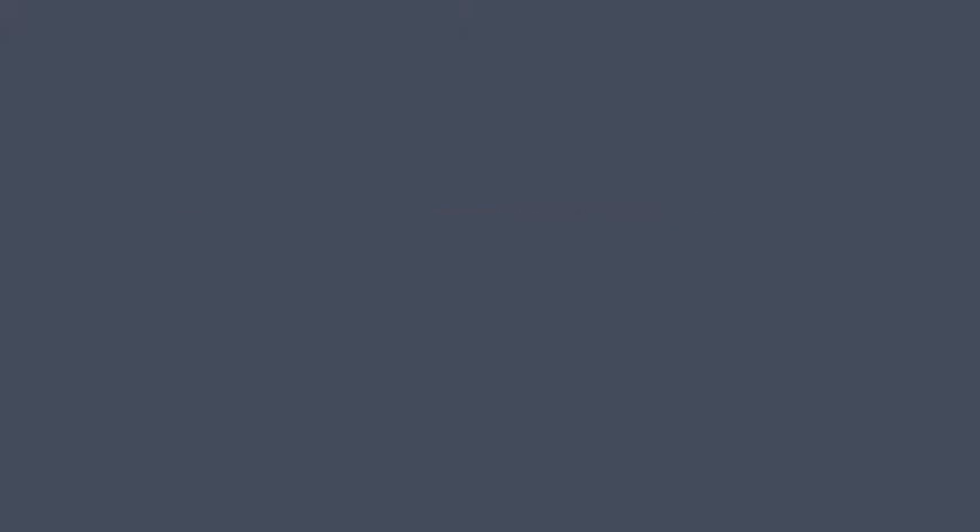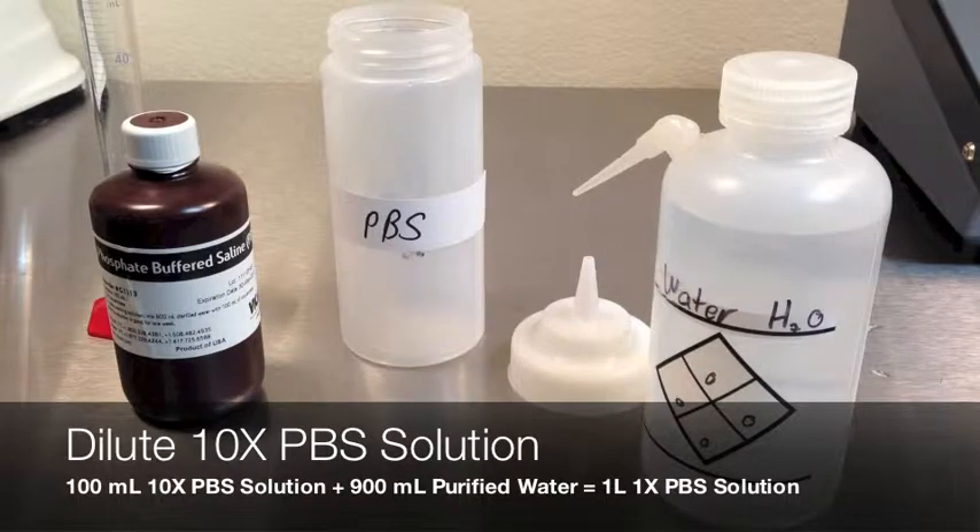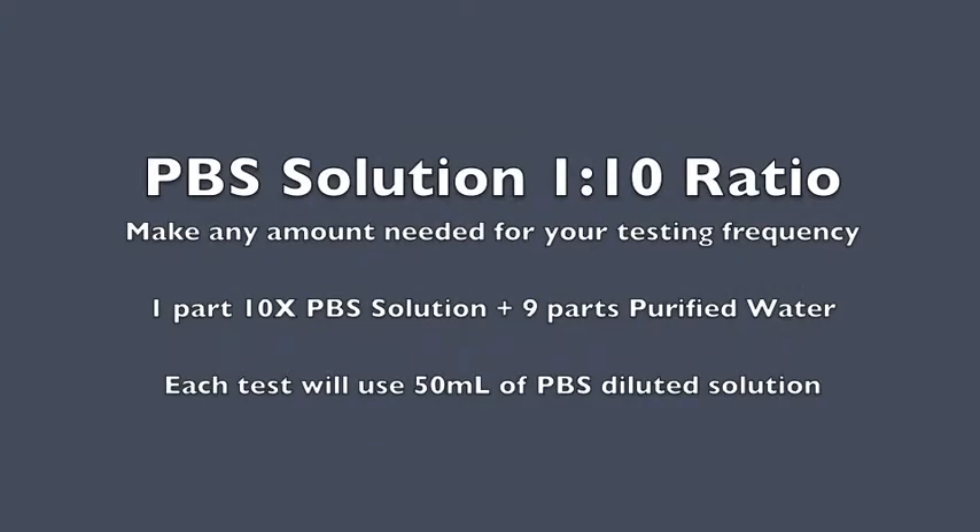The phosphate buffered solution, or PBS, is shipped from Vicam in a 10x concentrate. Combine 1 part concentrate to 9 parts purified water. Each test will use 50 milliliters of solution. If you make a large batch, it is shelf stable for 1 week.